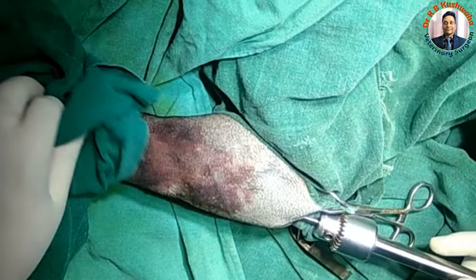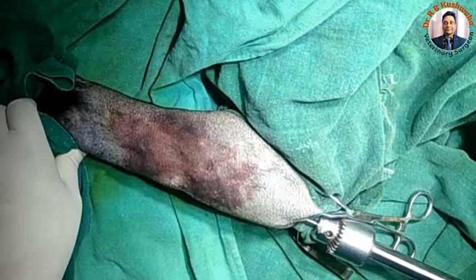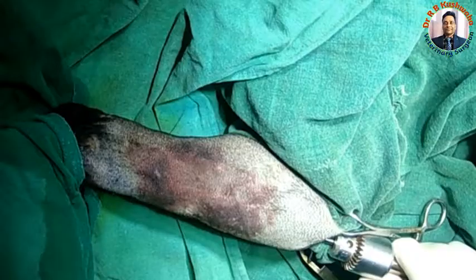It seems the pin is now going because it is moving, so I think it has gone into the distal segment.